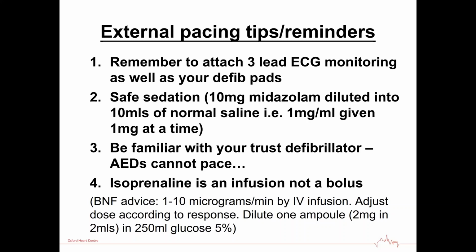Do be familiar with your own defibrillator. So when you do start back to practice, you saw there that was the Philips, which is set to start pacing at a high amplitude. And by amplitude, I mean the energy given to start pacing. And the higher the amplitude, the more uncomfortable it is for the patient. LifePak, as I mentioned, on the other hand, do not start high, they start low, and you have to increment until you get electrical capture.